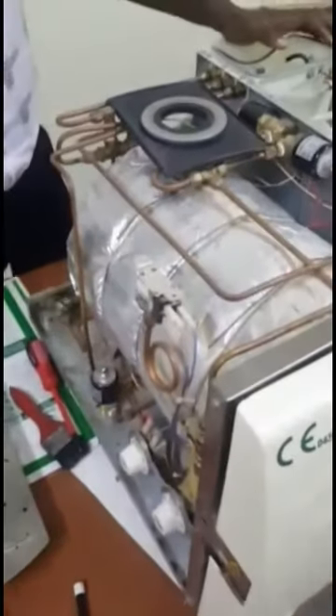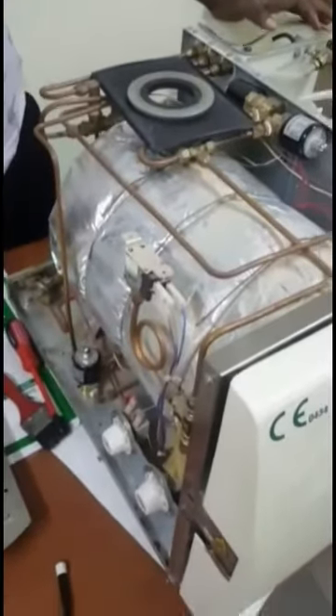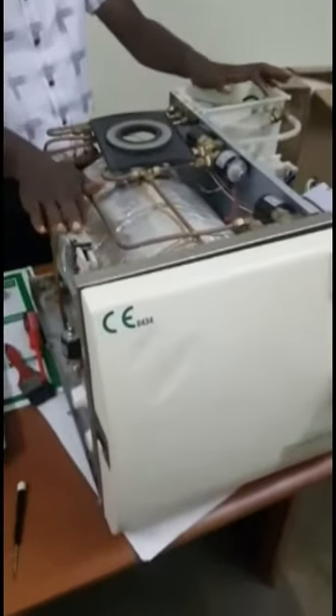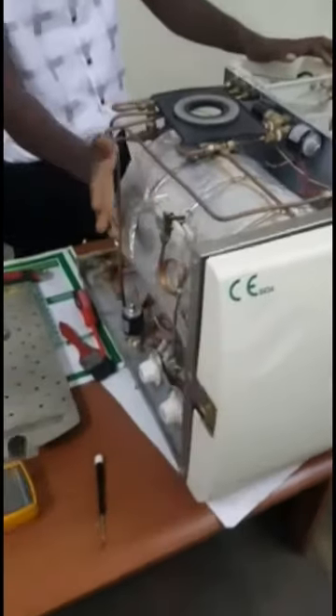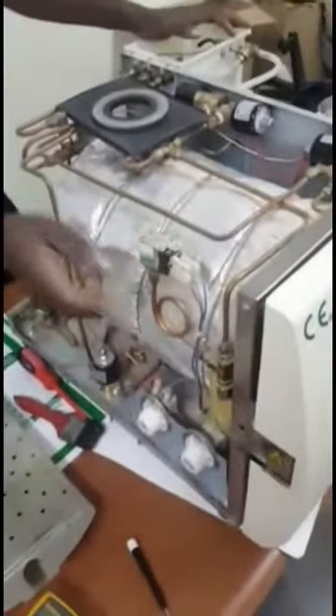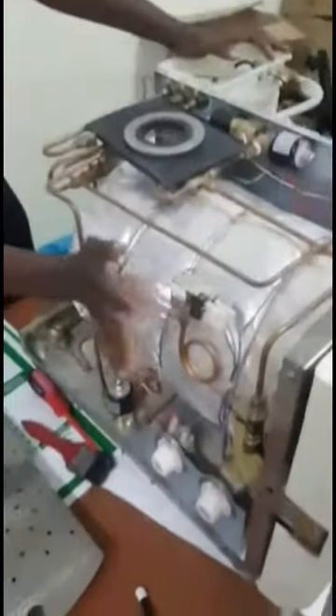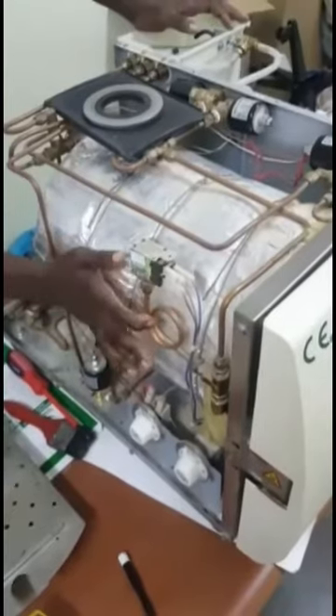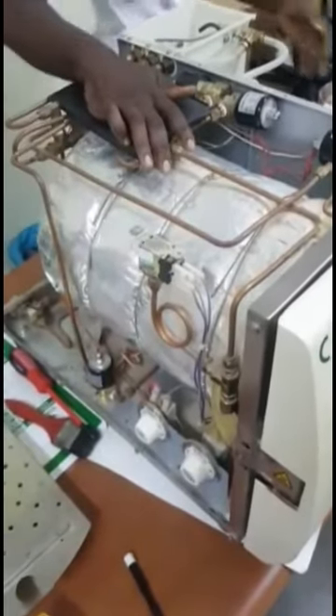Another problem that also happens is your pressure sensor. If the pressure sensor is not functioning, it is not able to maintain the required pressure in the system. This is the pressure sensor. If this is faulty, you will not be able to achieve your sterilization.